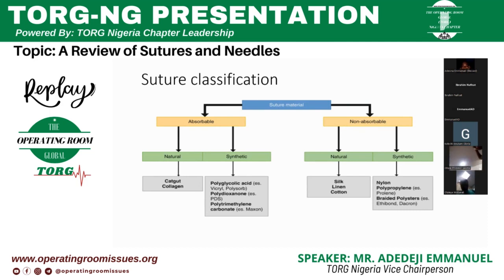So there was a development over the plain catgut, which was the addition of chromium salt. The chromium salt was said to strengthen the tensile strength of the catgut, so it lasts longer than the usual plain catgut.